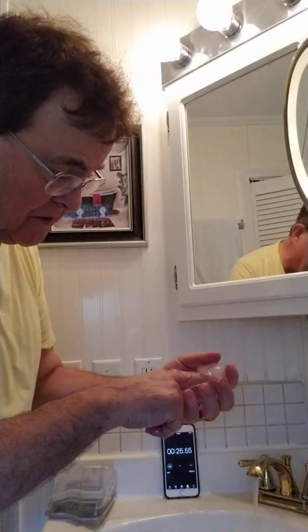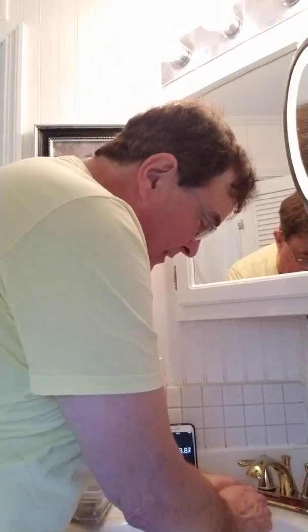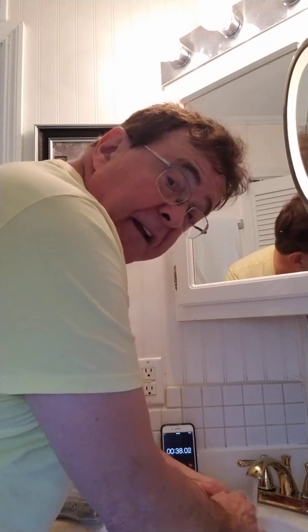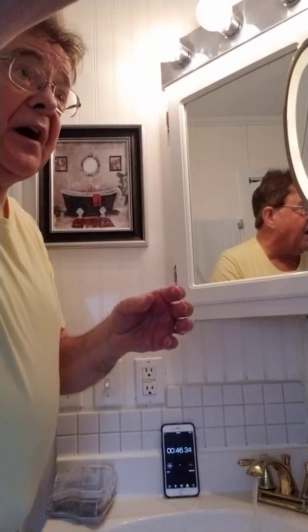I wet it down and I'll just rub it around on my fingers, just get my fingers into those little nooks and crannies. With this dish detergent, you don't have to really let it sit for 30 minutes or anything weird like that. It's just a matter of getting it covered and cleaned off. And there it is. It's got a little bit of water in it, and I go sit it up to dry.